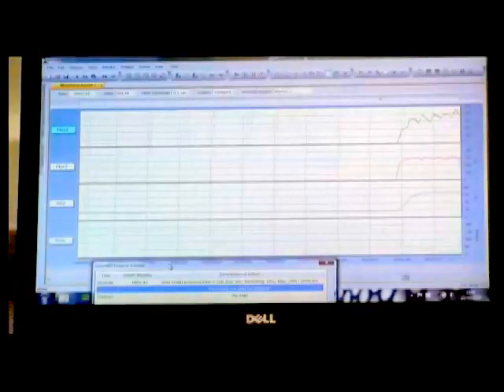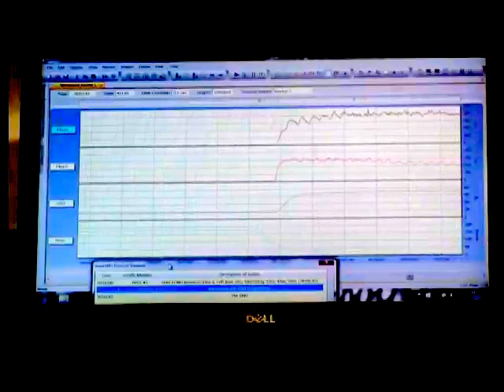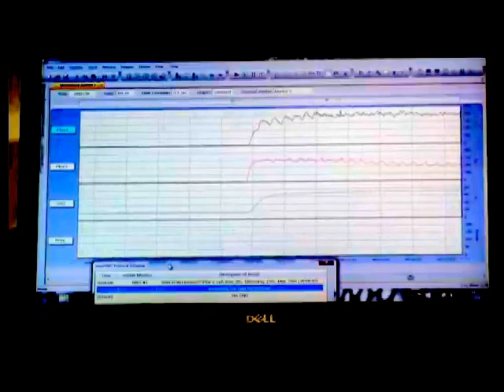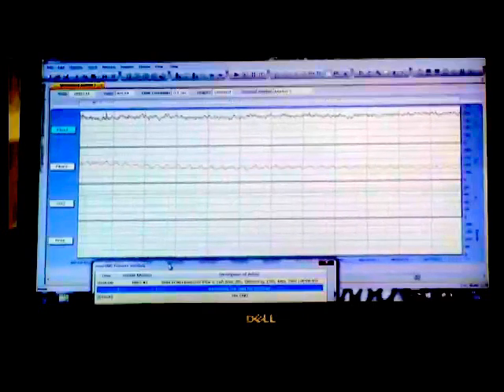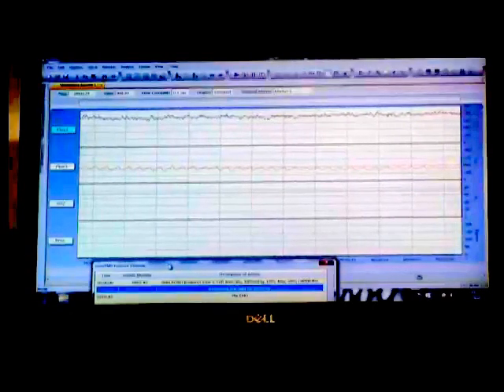So there's the pressure cuff deflating. You can see the pressure trace with the pressure decrease and the increase in blood flow accordingly. We now carry on the measurement for another 4 minutes while the hyperemic effect returns to baseline.